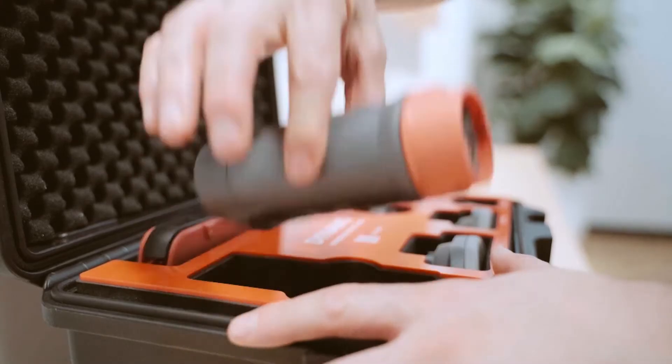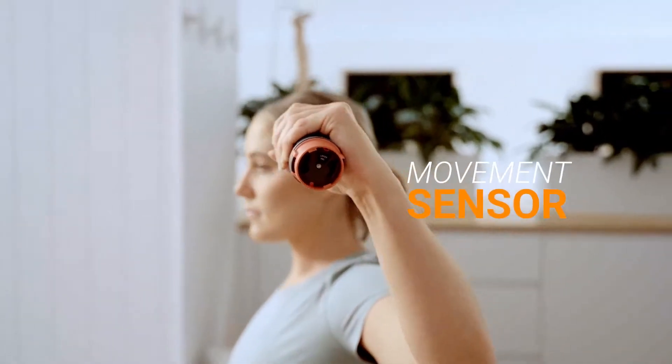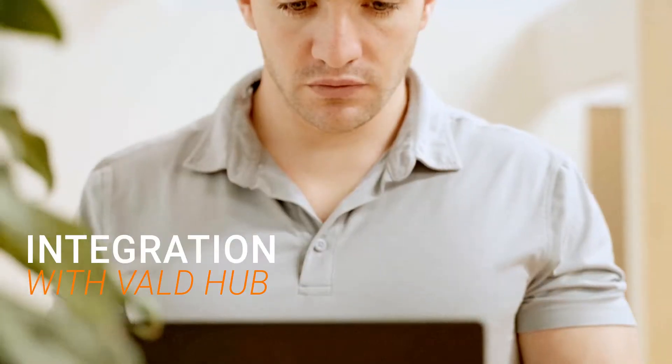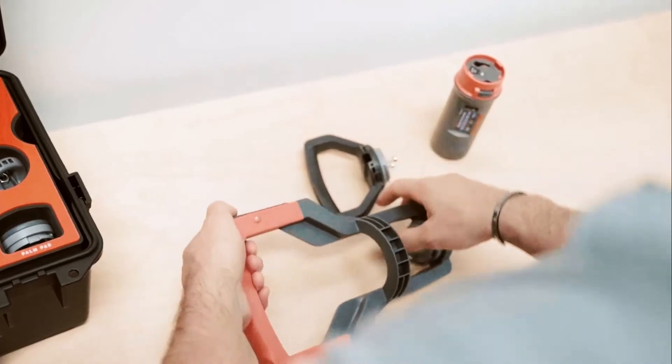Featuring a wide range of smart attachments and accessories, an embedded movement sensor, intuitive mobile apps, and end-to-end integration with VALD Hub. DynaMo is the handheld testing system the industry has been waiting for.